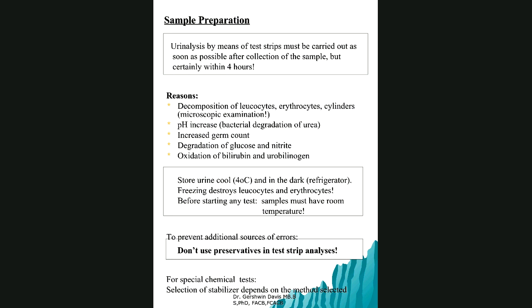Right, a few points about urine collection that are important to keep in mind. The first one, way on top here: normally you should do a dipstick right away. You collect it in your container, and you pour some for dipstick and some for MSU for CS. Do it right away. But if you cannot do it right away, then you need to put it in the refrigerator, within 4 hours, as close as possible to that. Then you can do the analysis later.